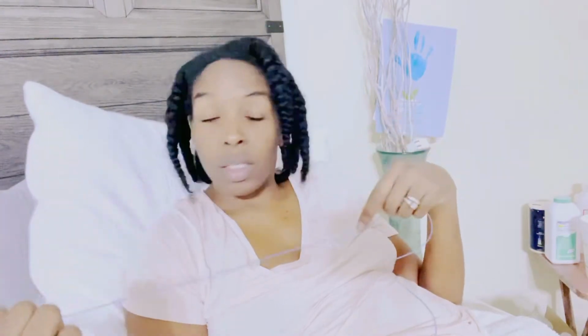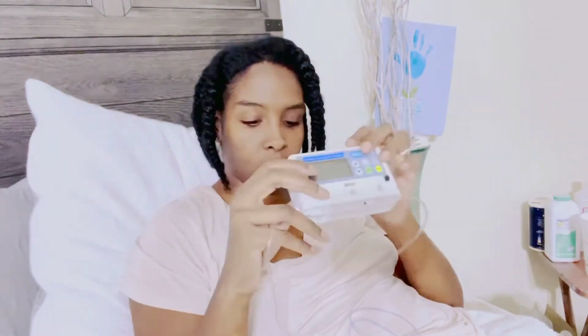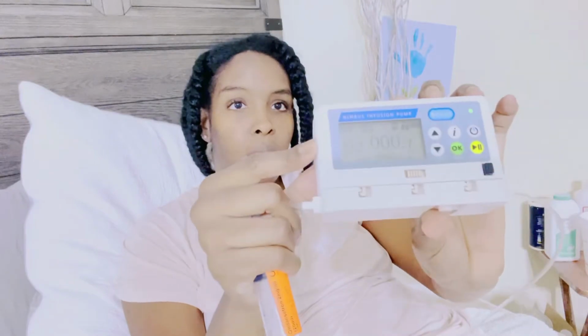Today I am going to show you how I change out my site and part of my cord for my Zofran pump that I have for hyperemesis. So I'm going to show you my pump real quick. It's connected to me, of course, and it shoots out however much medication I need per hour.